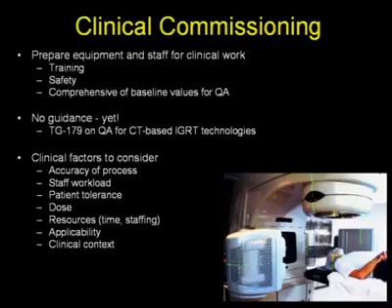And it's also at this time that additional safety issues are addressed and comprehensive baseline values are acquired for quality assurance. As for many new technologies, there is no guidance yet for image guidance technologies QA. However, the AAPM TG 179 was created last fall with the focus on quality assurance for CT-based IGRT technologies. A white paper is in the works and should be published within the next year or so.